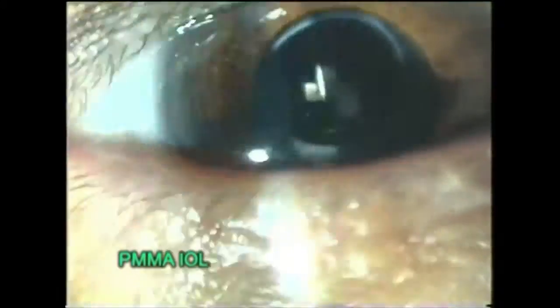On the 1-month follow-up visit, she complained of washed-out vision that was constant throughout the day, only in this eye. Here we have an illustration of the patient's visual perception made by herself. Post-operative best-corrected visual acuity was 20/20. The slit lamp examination was remarkable only for a slight posterior capsule opacification. The IOL was centered within the capsular bag, and its edge was covered by the capsulorhexis margin.